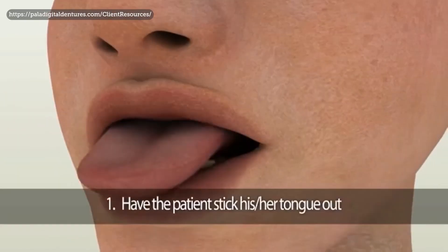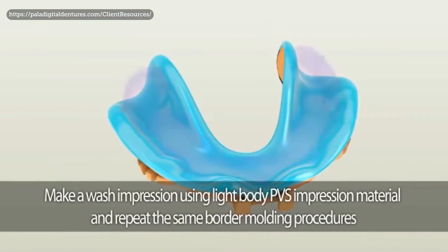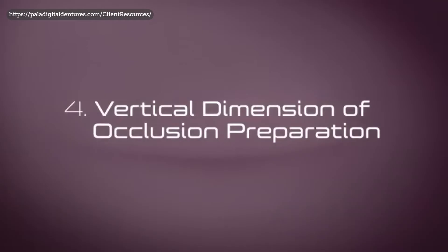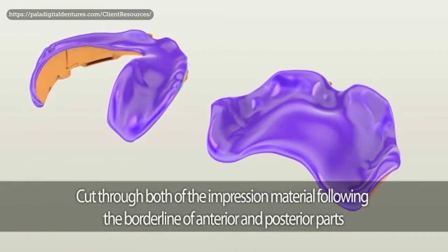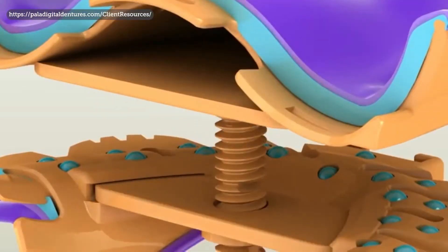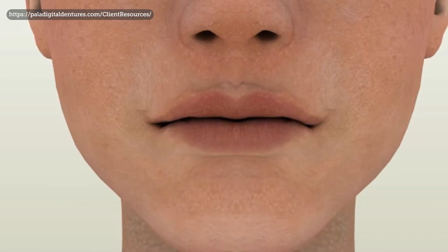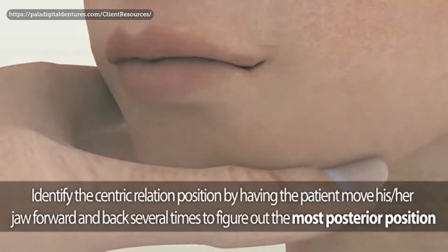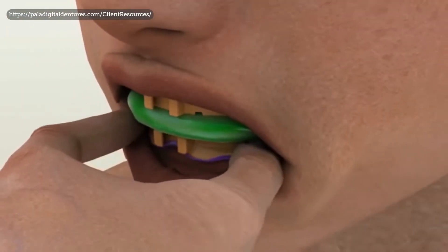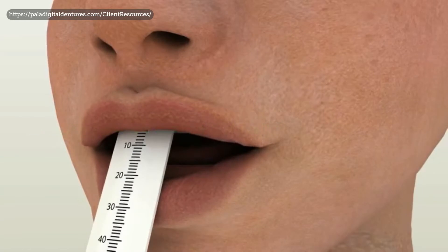The Pala impression trays are still available on their website to purchase today. The method for achieving accurate measurements using this system is a bit time-consuming compared to typical traditional methods — clients would report it taking well over an hour, and Pala themselves recommend clearing an hour's worth of chair time. But if you could theoretically get a first impression with all the information gained from bite blocks or wax rims, you could theoretically have a final prosthesis made in only two visits.